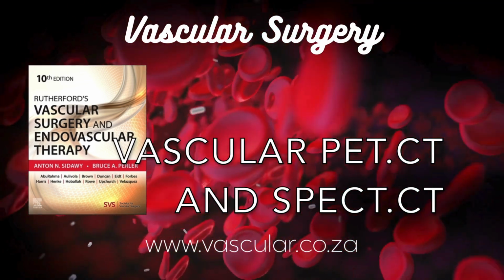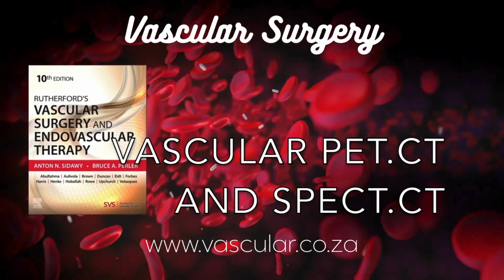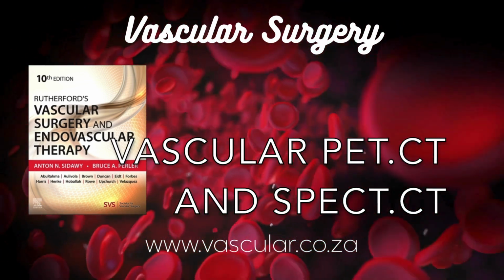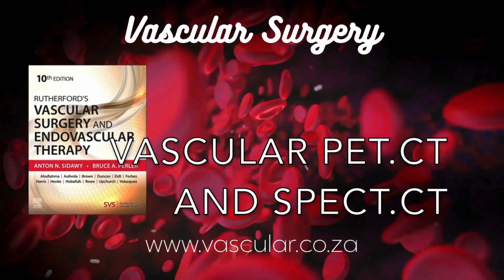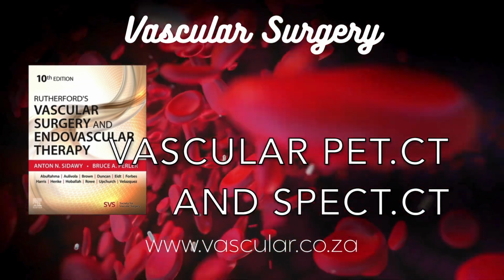CT uses X-rays, gives you that detailed anatomical picture, the structure. So you fuse them. Bingo. Modern scanners combine PET or SPECT with a CT scanner in the same machine. You get both scans almost simultaneously. The computer then overlays the functional PET or SPECT image onto the anatomical CT image. The hybrid approach, SPECT/CT or PET/CT.